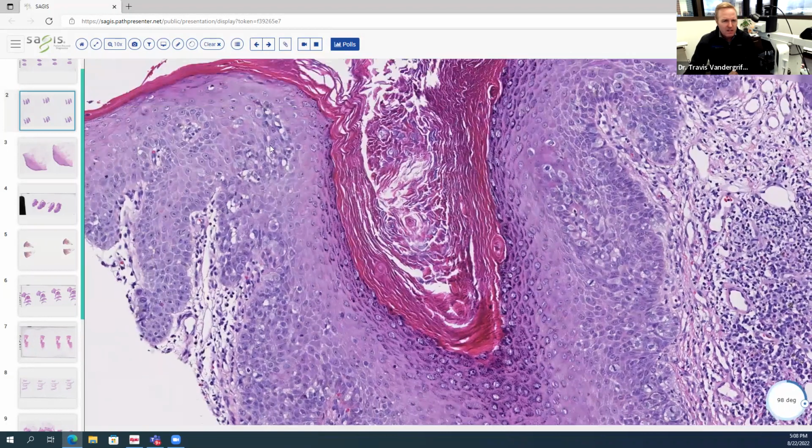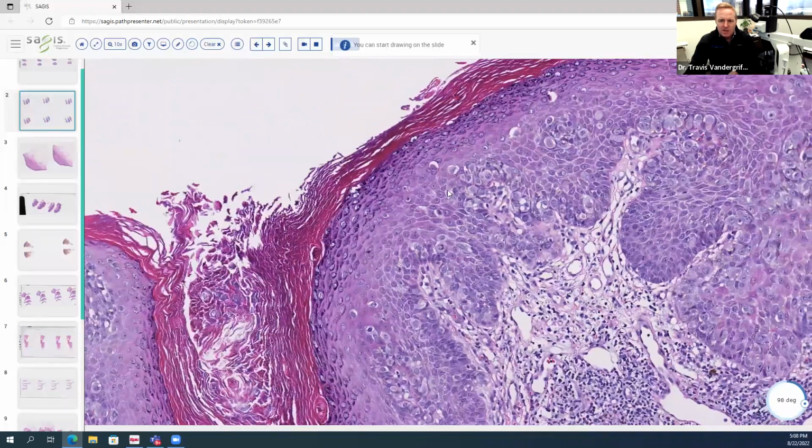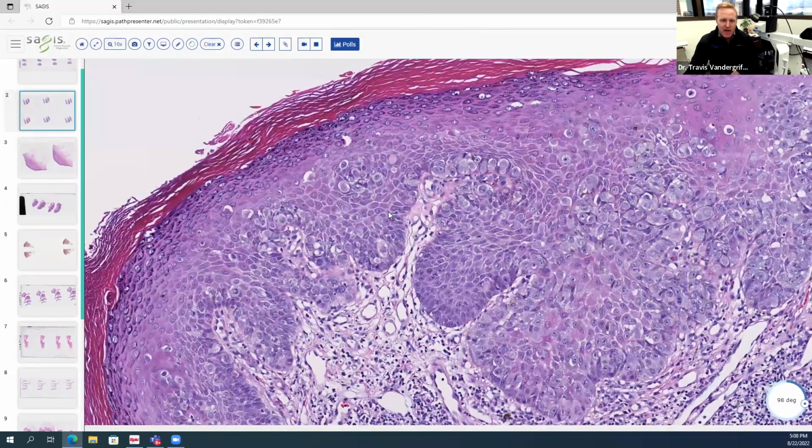So you've got these atypical kind of large cells scattered at higher levels of the epidermis. So this is a good example of a pattern that's called Pagetoid scatter. So Pagetoid simply means that the process resembles Paget's disease. And Paget's disease historically was first described as a skin manifestation of underlying breast cancer, in which breast cancer cells come out on the skin affecting the nipple. And so to say that something is Pagetoid means that it resembles Paget's disease.